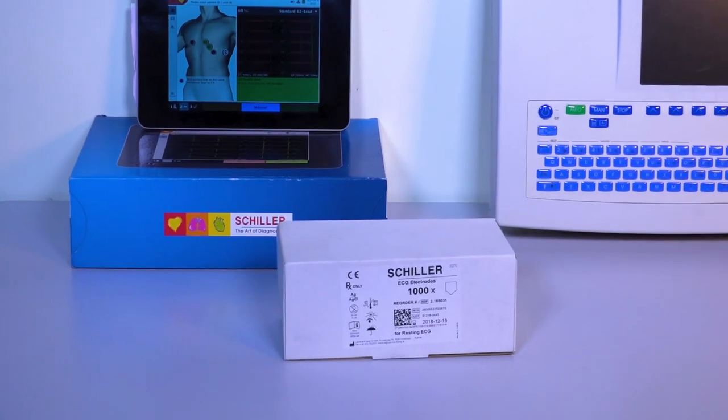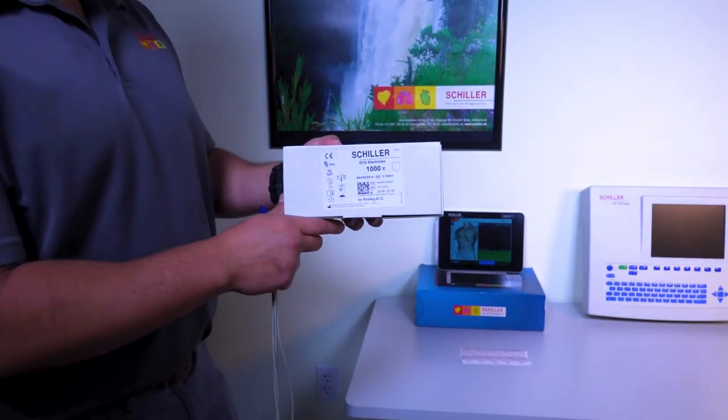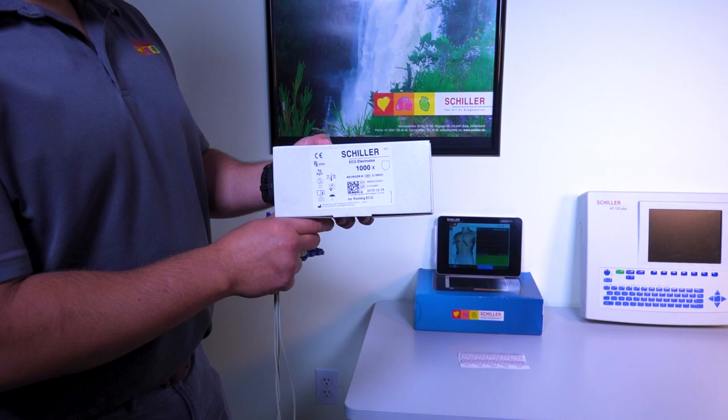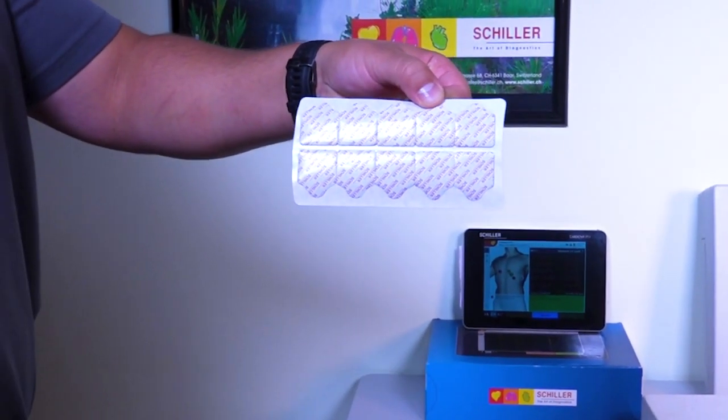Let's talk about the ideal resting ECG electrode, the Schiller BioTab. The Schiller BioTab's electrodes come in boxes of a thousand electrodes. Our bioadhesive electrodes are latex-free for hypoallergenic contact.